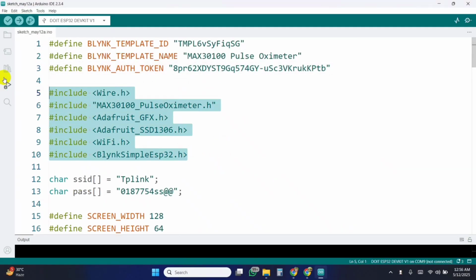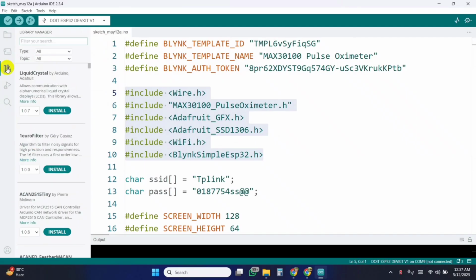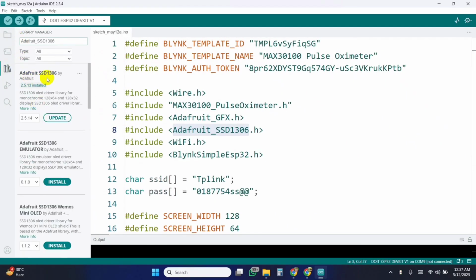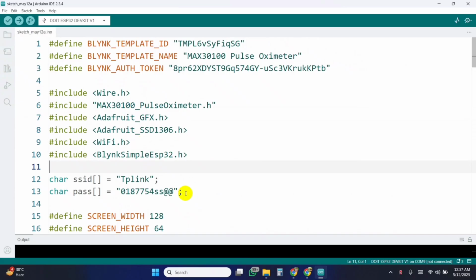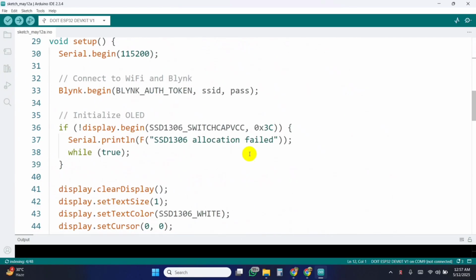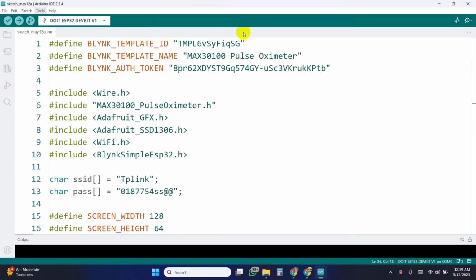In the Arduino IDE, include the required libraries for the MAX30100 and OLED, and install them manually if needed. Enter the name and password of the Wi-Fi network you want to use, and verify the OLED I2C address. In my case, it's 3C. It can be different for the display you're using. Once everything's ready, select your board and port, and upload the code.